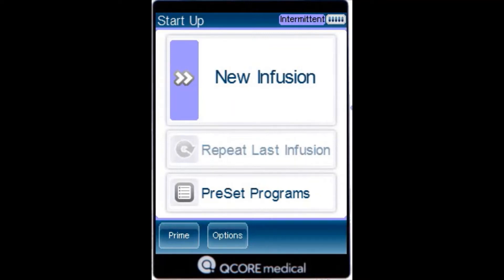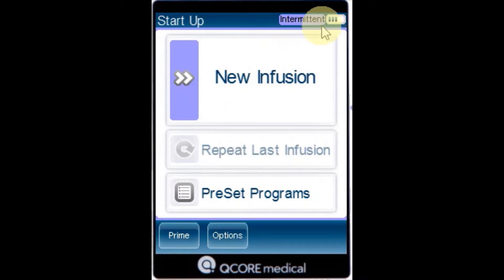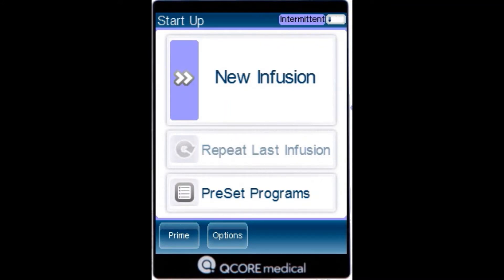To begin a new intermittent infusion, from the indicator bar, verify that the pump is in the intermittent mode. From the startup screen, select new infusion.